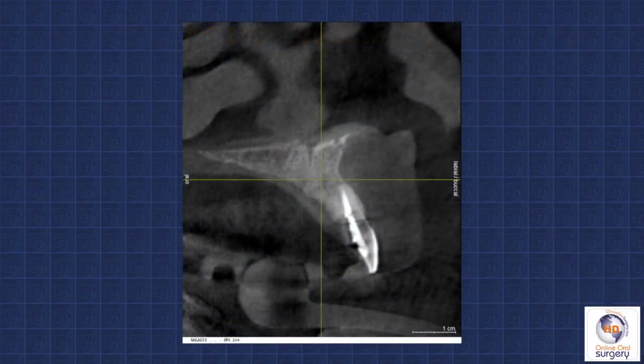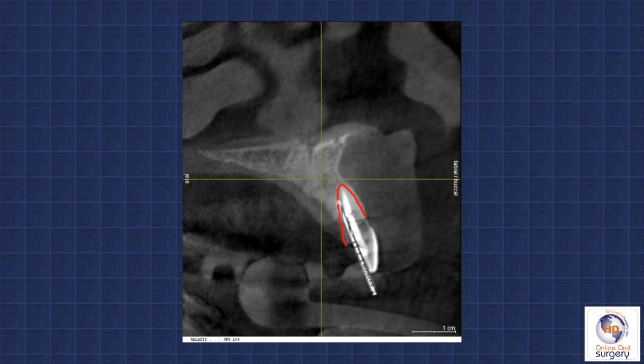Here's a typical maxillary central incisor that needs to be extracted. And if we take a look at it, here is where the extraction socket will be once the tooth is removed. Now, it would be great if that's where we need to place the implant. However, where the implant needs to go is further palatally and more apically and angulated a little bit more vertically. And so when we attempt to do this freehand, the problem is that here's our socket, and when we start attempting to drill, we may use a Lindemann burr or a small round burr to start it. Then we come in with our first osteotomy drill, attempting to drill straight into the intended position and angulation and depth. The problem is that we've got bone on one side, basically on the palatal, and air on the other — that being in the socket.